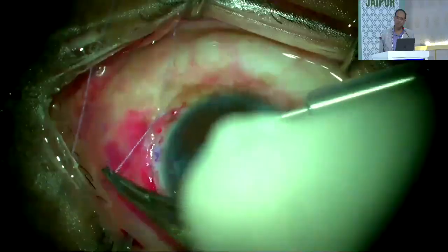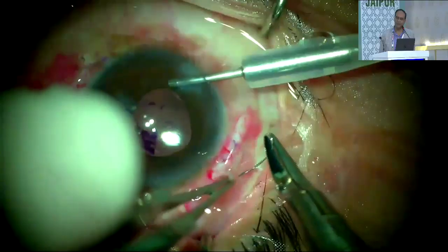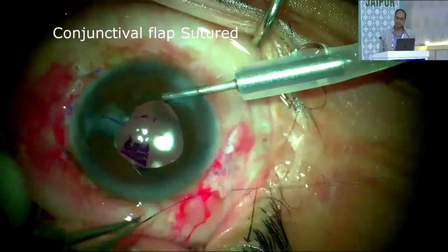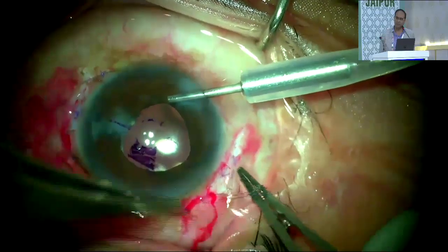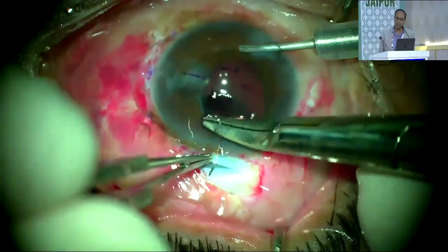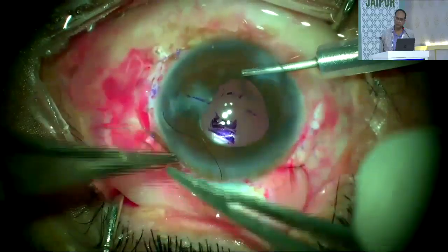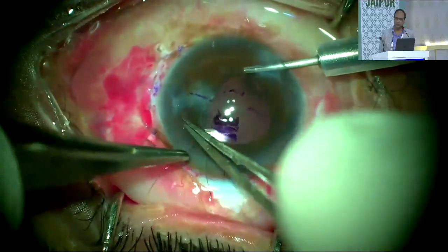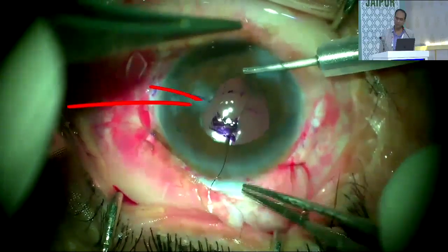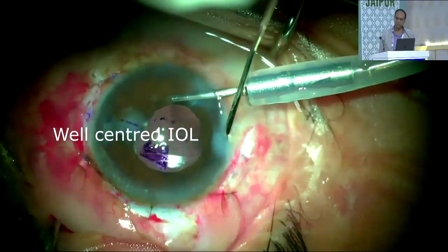Some people also leave the scleral pockets unsutured, but since it's a secondary implant, it's better to suture the pocket. Finally, a single 10-0 nylon suture is applied to the scleral tunnel, and the side port is hydrated.